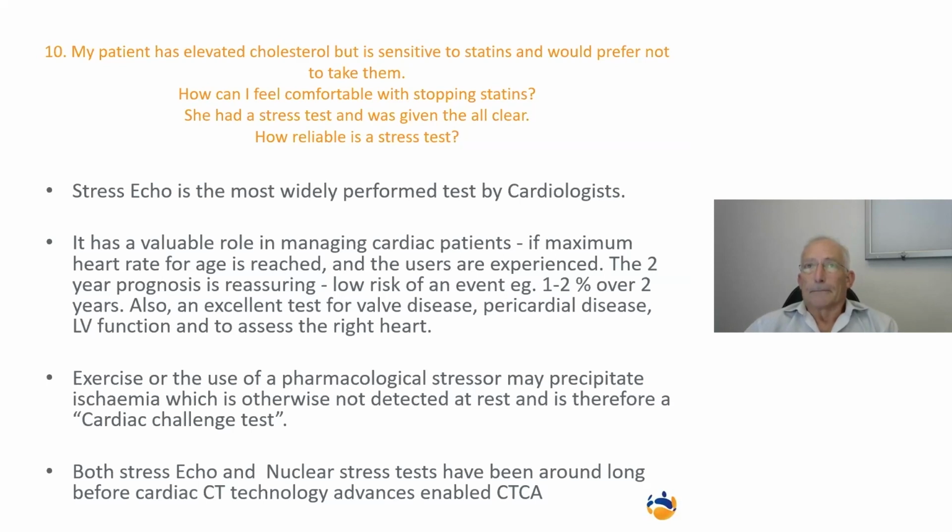Yes, so interesting question, and one which needs to be better discussed with patients. Stress echo is a very good screening test for cardiac disease as a whole, because some patients present with aortic stenosis, present with LV dysfunction, present with a pericardial effusion, and that can be picked up very easily on the pre-testing echo pictures.